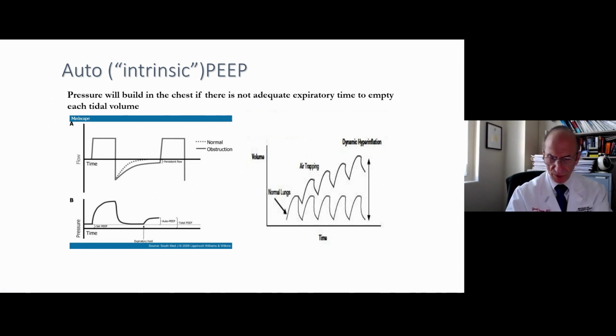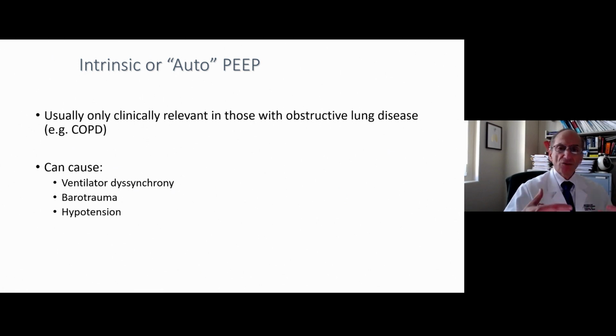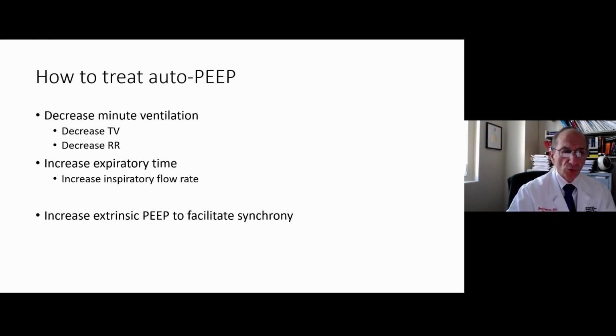That can have consequences because, as we just said, it does increase intrathoracic pressure. It can therefore decrease cardiac preload, and we can see hemodynamic consequences from that. This is usually only seen in people with obstructive lung disease who simply need more time to exhale. If they have bad obstructive lung disease, asthma would be another example, sometimes simply allowing more time for exhalation is all that's needed. But it can cause great discomfort for patients, desynchronous breathing, and then, of course, barotrauma and hypotension, as we just said. So it is very important.